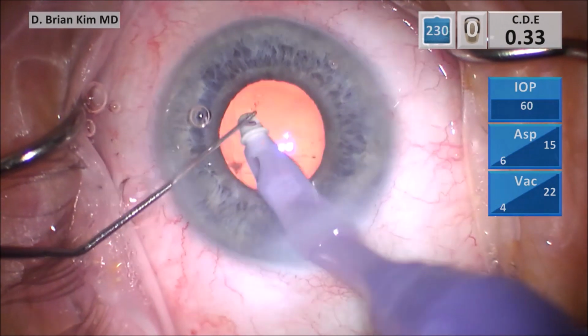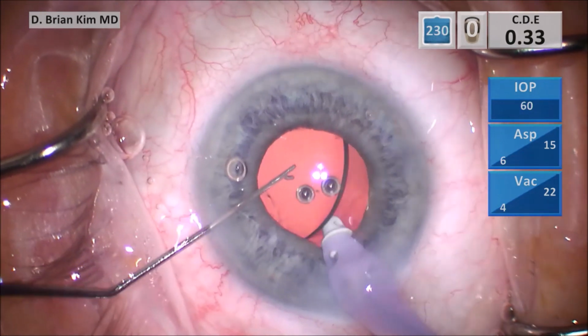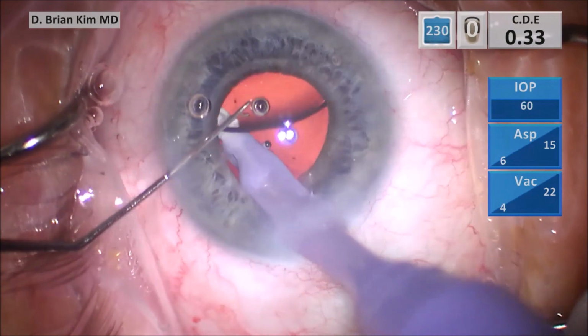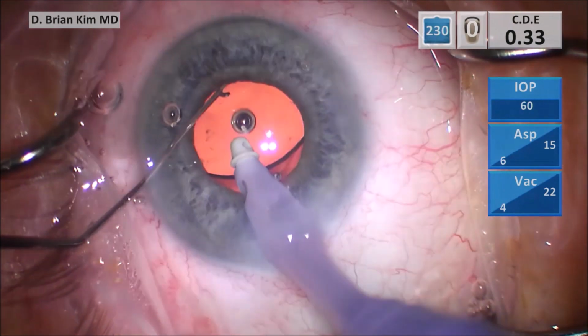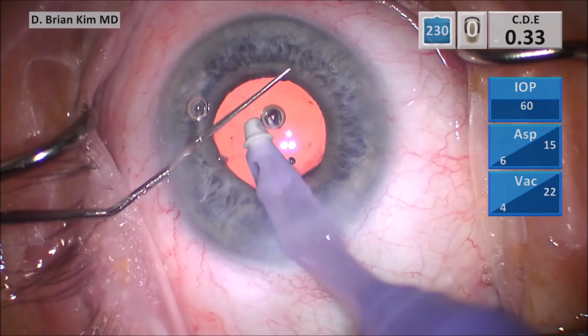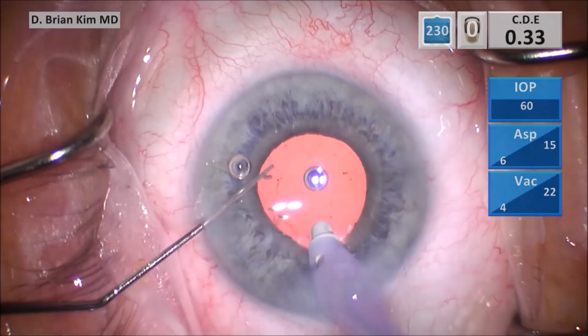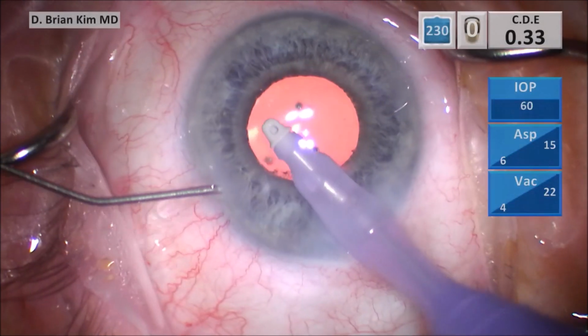And what I do is I tilt the lens such that I can make sure I get between the lens and the posterior capsule, but then by pushing it a little bit away from me, I'm also making sure that both haptics are within the capsular fornix. I like to use this Maltzman instrument sometimes just to make sure that both haptics are completely in the bag.